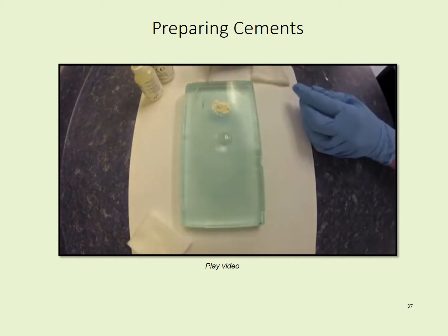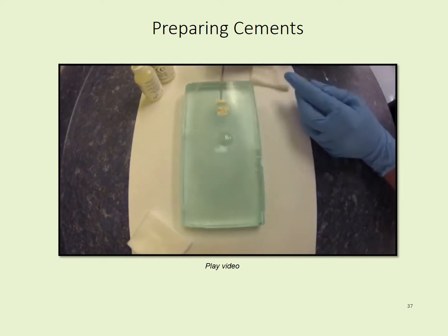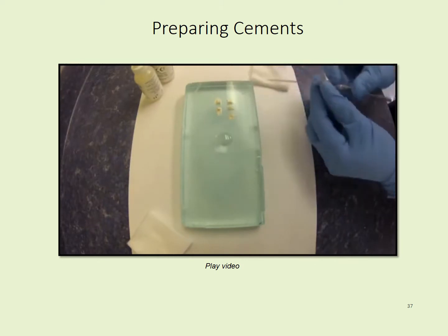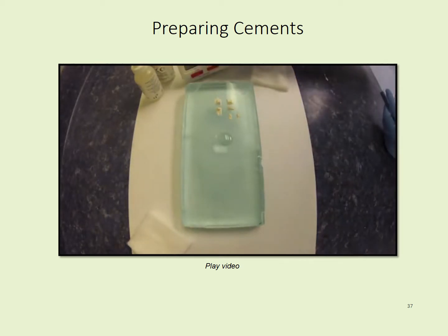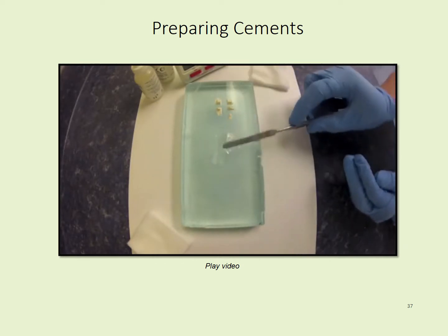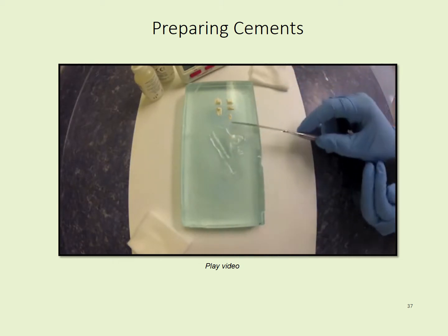As nearly as possible, we want to form a rectangle with our powder, and then first divide it into quarters, and then one of these quarters is divided into 2/8, and then the 1/8 is divided into 2/16. Each increment is timed as we mix the powder into the liquid. We start with our smallest increment, and we're going to mix that for 15 seconds.